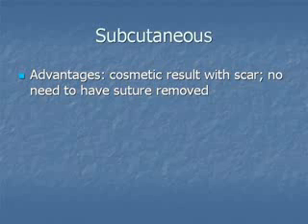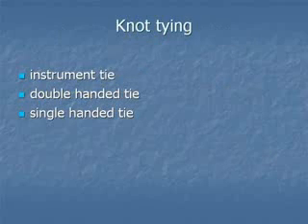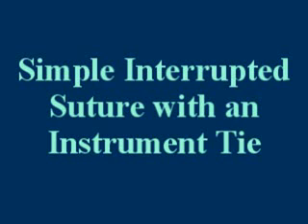Subcutaneous sutures may provide a better scar, and there is no need to have the suture removed. Compared with interrupted sutures, continuous sutures are quicker to place and divide tension equally along the skin edge. Locking sutures traditionally are thought to provide better hemostasis, non-locking to provide less risk of tissue necrosis. In the upcoming videos, we will demonstrate an instrument tie, a double-handed tie, and a single-handed tie. First, we'll demonstrate a simple interrupted suture with an instrument tie.